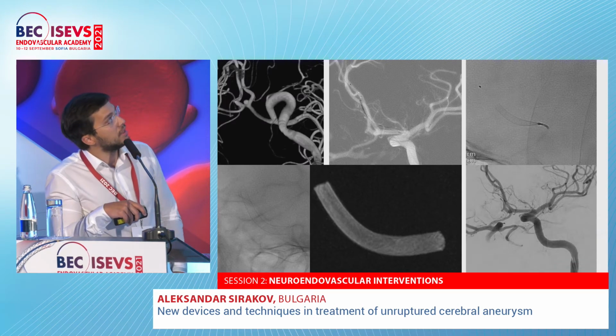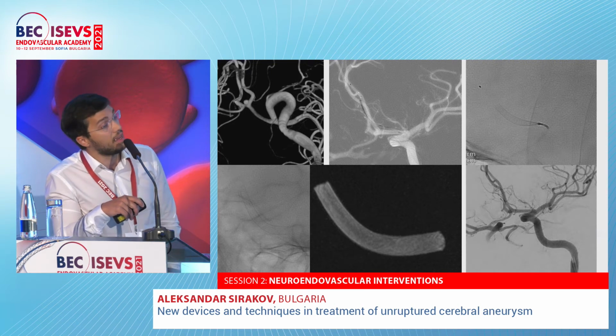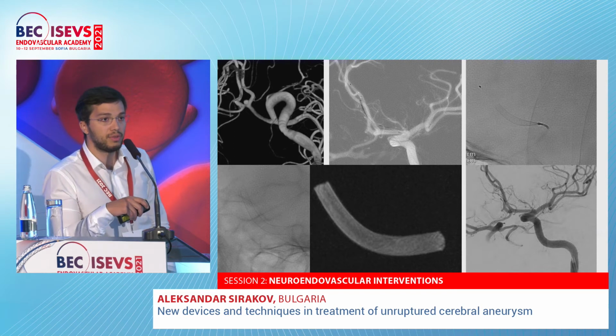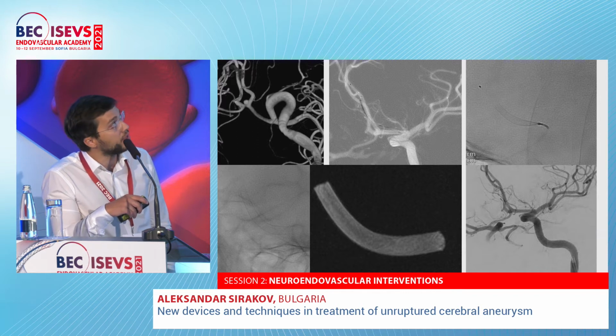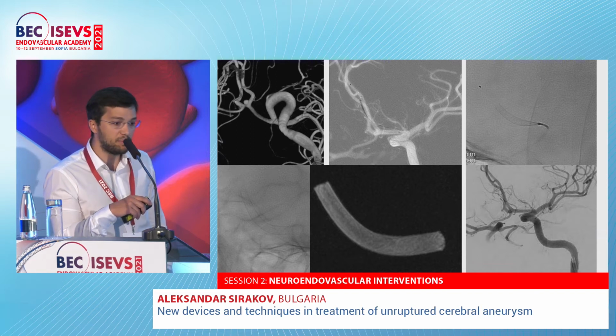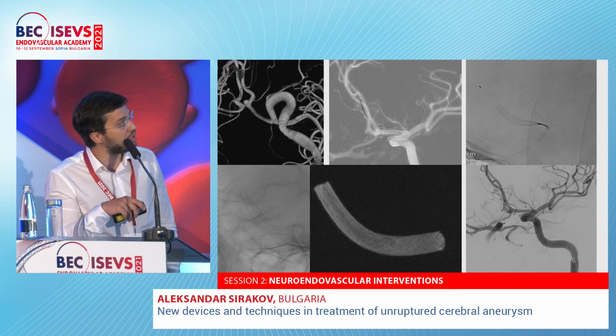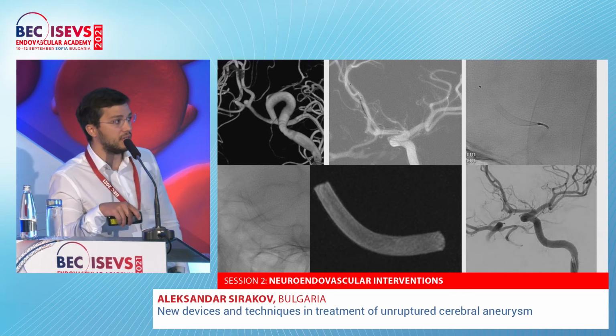Another tricky aneurysm, actually this aneurysm is unruptured, but it showed progress on the follow-up. It started to increase in diameter, so we thought it's a good idea to propose a treatment to the patient. In such cases, when you have a broad neck or a very, very small sac, we prefer to deploy a stent. That's the P64 over there, completely deployed across the aneurysm from proximal A2 to distal A1 across the ACOM complex. That's the VASO-CT reconstruction. You can see a perfect tubular shape implant that covers the aneurysm over there.